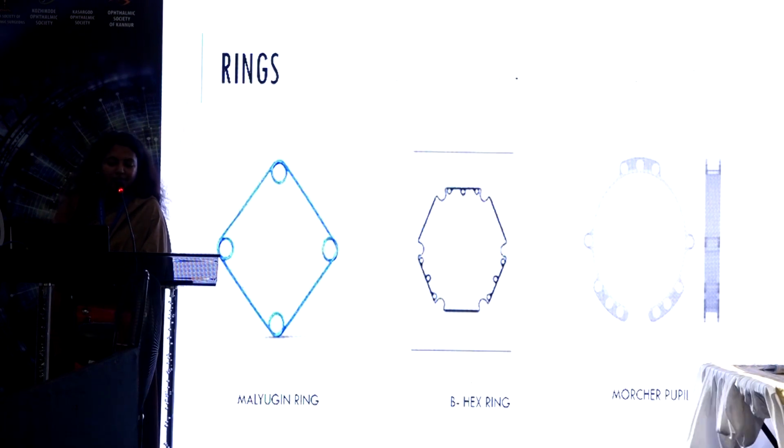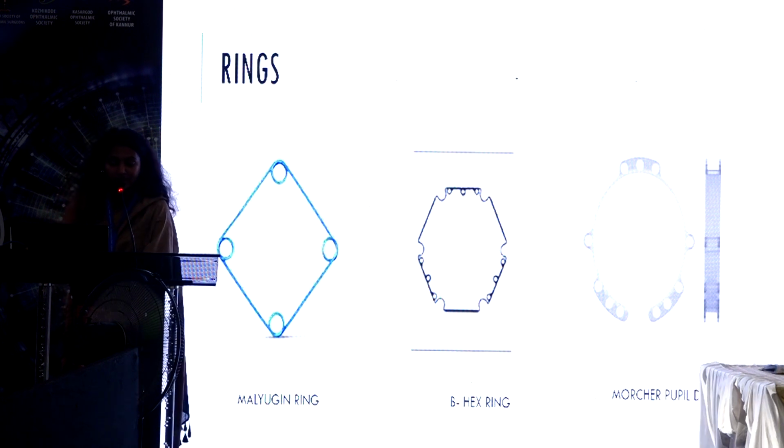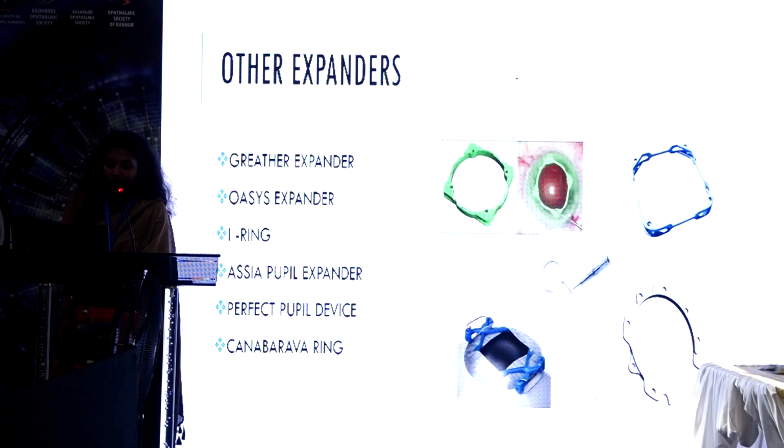Coming to the rings, there are various rings available. The most commonly used worldwide is the Malyugin ring. We have our Indian innovation, that is by Dr. Bhattacharjee, that is a BHEX ring. And there are other pupil expanders used worldwide, which are not that very popular.